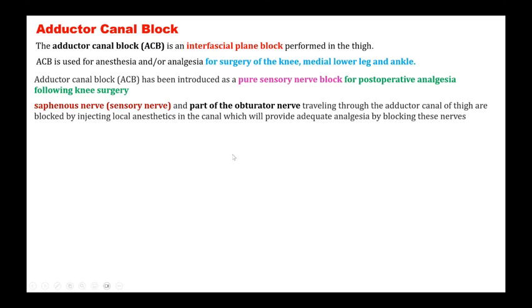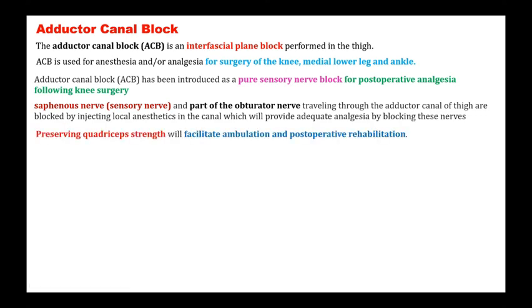That is the reason why you cannot use a nerve stimulator here, because sensory nerves are not stimulated. You cannot have objective evidence of the nerve being stimulated unless it has a motor component. So it is mainly done using ultrasound. Without the ultrasound, you cannot do that.